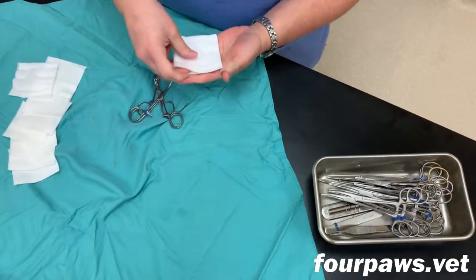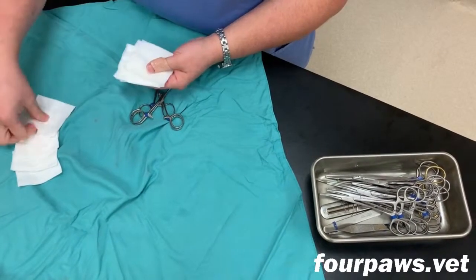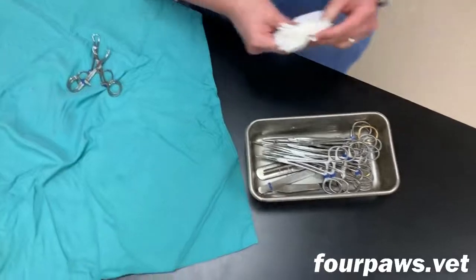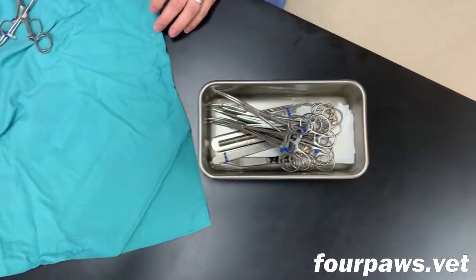It is also important that the assistant who is preparing the pack count out an exact number of gauze sponges to place in there. It is important that we know exactly how many are in there in order to assure that none are accidentally left behind when the surgery is completed.